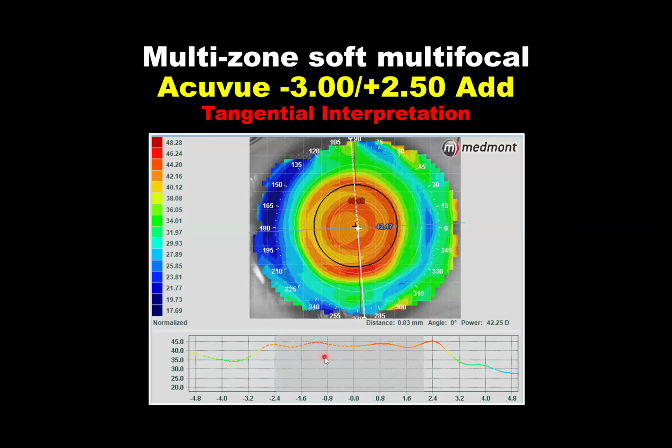Interesantísimo. Y a veces eso, pues la córnea es transparente, el lente es transparente. ¿Cómo saber si esas zonas están cayendo centradas como deben ser? Pues fíjense, como pueden ver ahí, el área gris un poco más oscura equivale a la pupila. Y ustedes pueden ver cómo la línea sube y crea unos pequeños valles, unas pequeñas montañitas, y cada valle y montaña corresponde a cambios en poder. Y cómo ese cambio en poder se riega o cae en el área de la pupila. Si está centrado, pues entendemos que es bueno. Si estuviera descentrado, podría causar problemas en la agudeza visual del paciente.